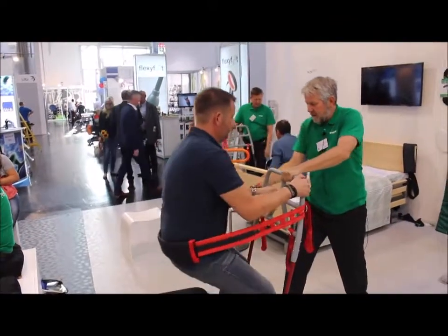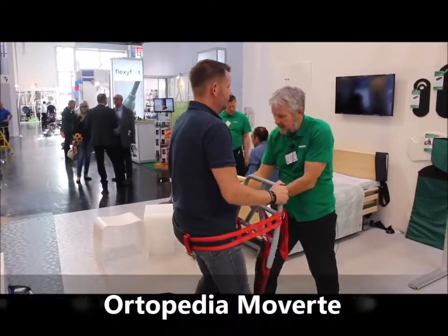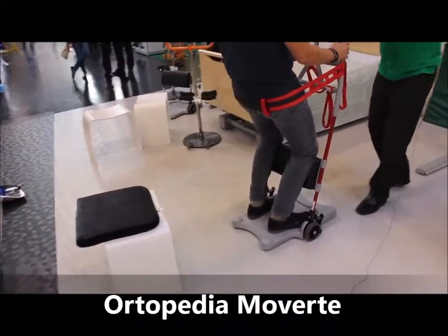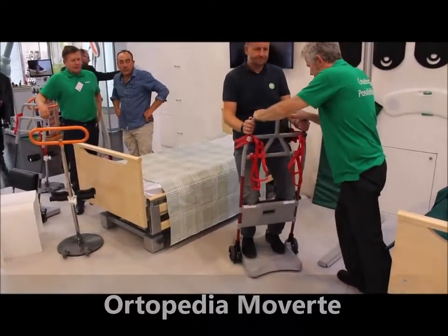One, two, three, standing up. I attach it so that Michael can be secured when I move him around. And then I move him around and put him down on the bed.